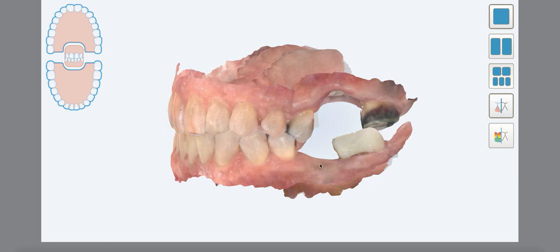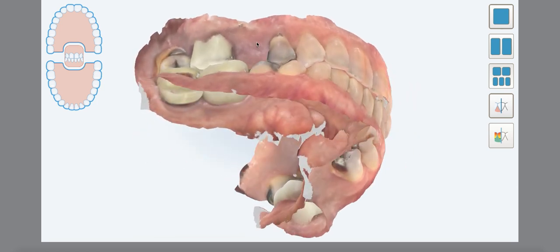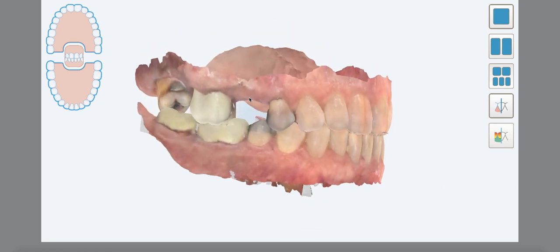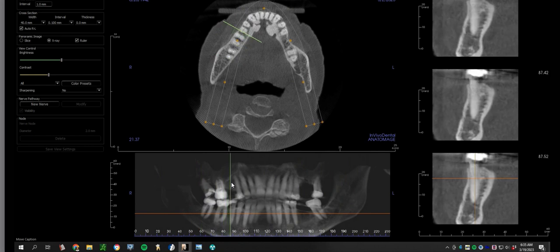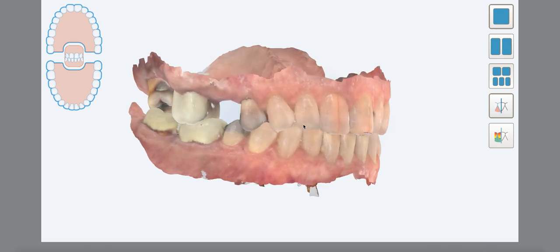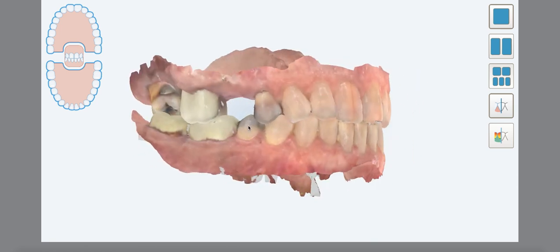So a bridge in the upper left, an implant here because of the fact that the bone here is really good. I also like the bone here, especially if this site has no pathologic nature to it. Again, if this tooth was removed somewhat recently, and based on the tissue look here, I would say that's of high likelihood that this tooth was removed in the past year. I don't think this particular site needs any bone grafting. So if we come over here, if everything heals well, that is a very good ridge to place an implant. So, great option would be 2 implants and a bridge, maybe a crown and a crown. That would be a very good cost-conscious option.